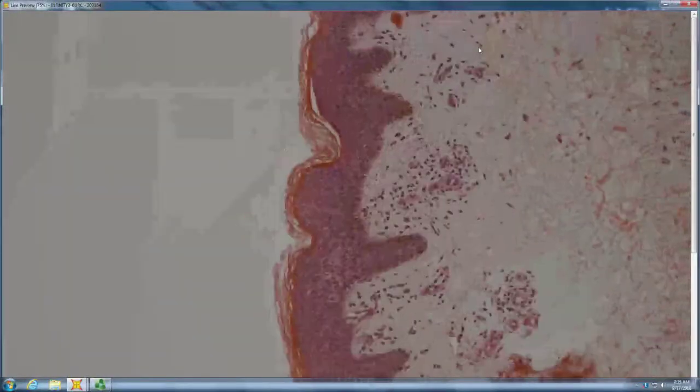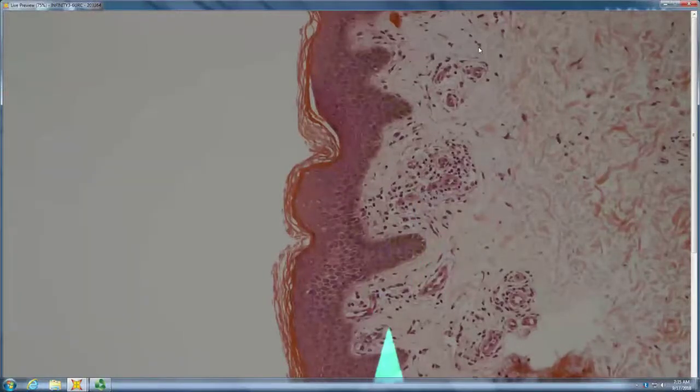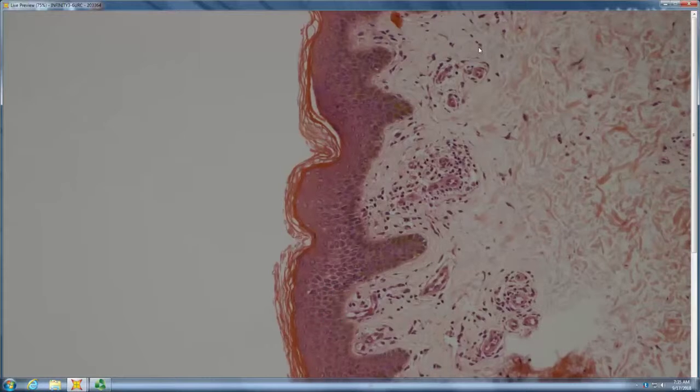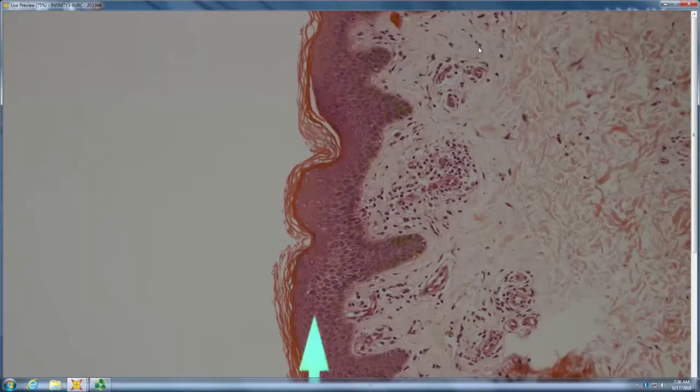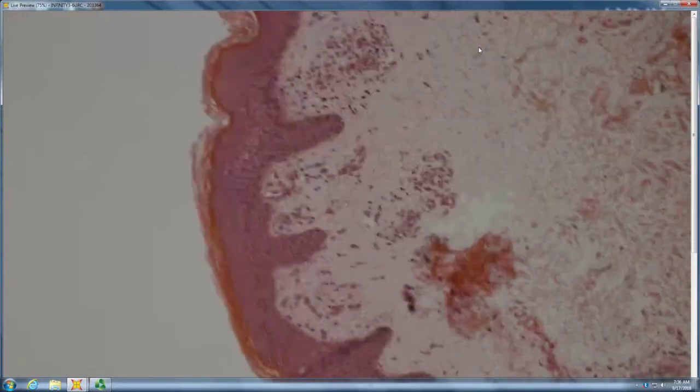Maybe PPD. If there is significant erythrocyte extravasation here, you might think of a spongiotic PPD. What kind of PPD is spongiotic? The Greek one, Doucas and Kapetanakis. The Greek names go with the sponge divers, or spongiotic. You think this is chronic? There is some hyperkeratosis, some papillary dermal fibrosis, right? So it looks like a subacute spongiotic process, but there's definitely some chronicity here in the papillary dermis.